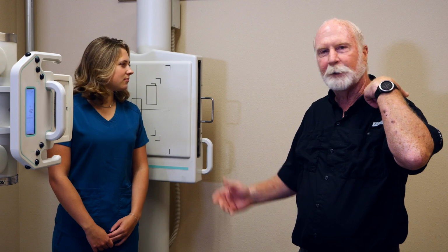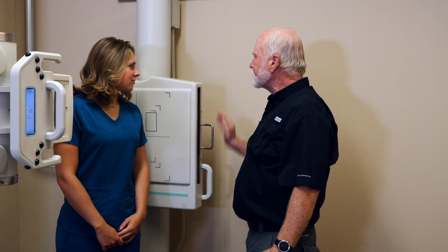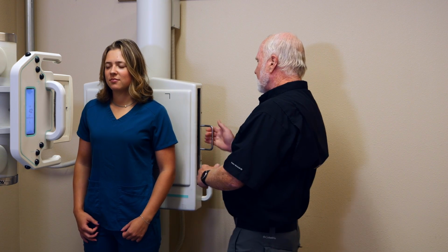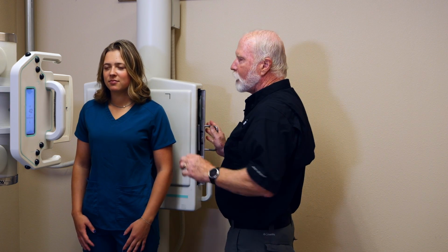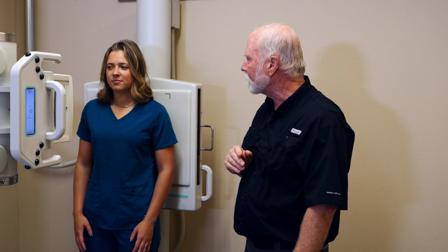So Lila's been so gracious to help us today. She's going to put her back up against our IR here. We're going to set her about midline. Got my left marker here, a little bit off center. Be aware, if you haven't looked at a radiograph of somebody before, a lot of people have some idiopathic scoliosis. It's not visible if you just look at them. So I never go too tight on my AP until I know that they don't have that scoliosis. I don't want to cut off any of the anatomy.